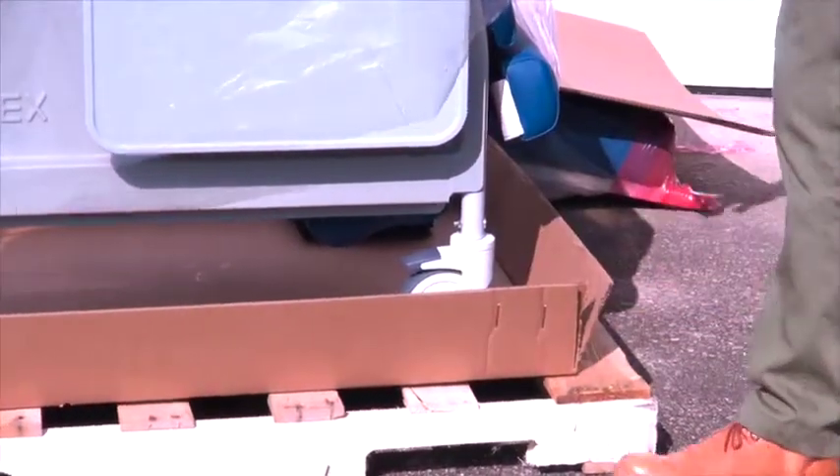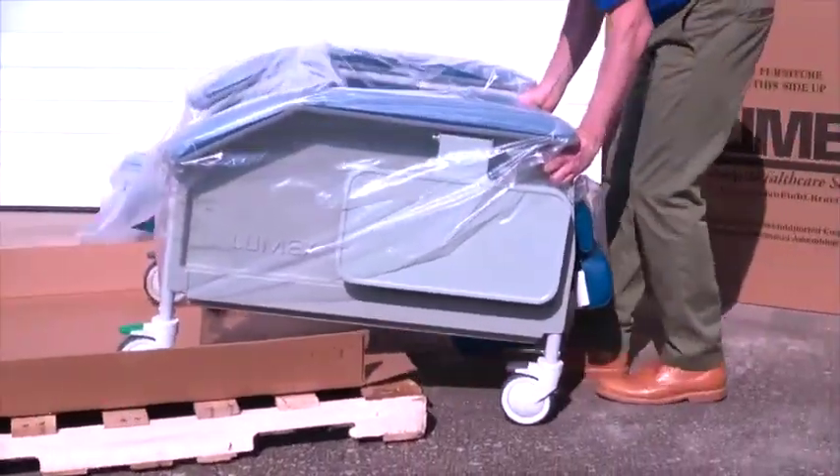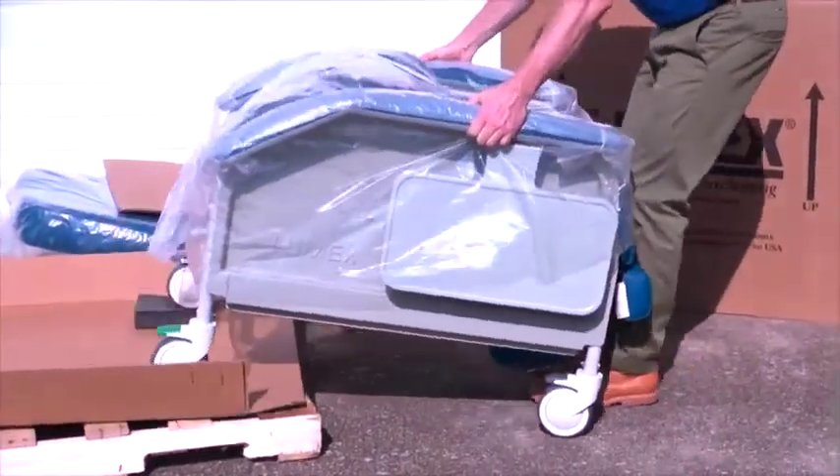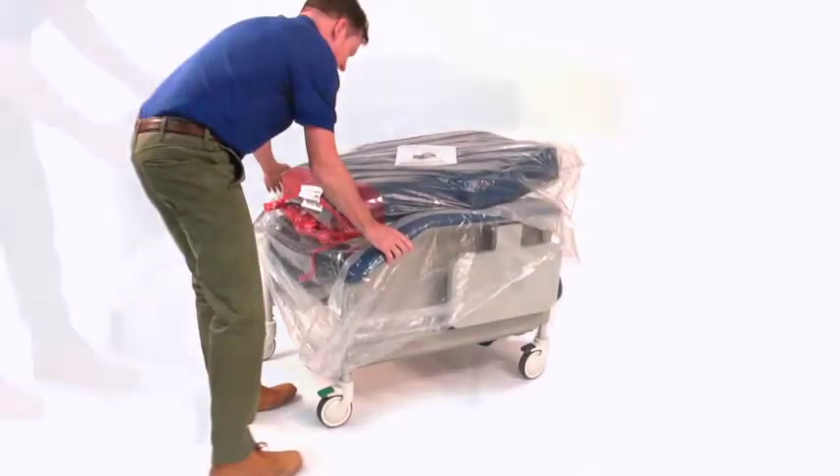Unlock each of the casters and step on the end of the carton and roll the recliner off the pallet. There is no need to lift the recliner. Once the recliner base is free from the carton, lock all casters by depressing on the black tabs and green tabs.